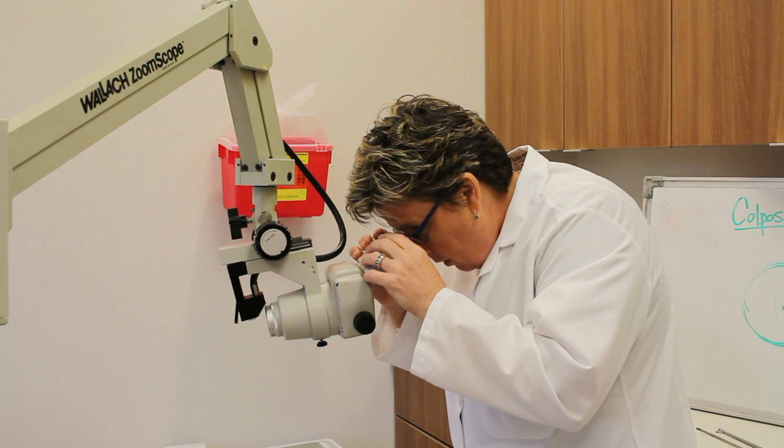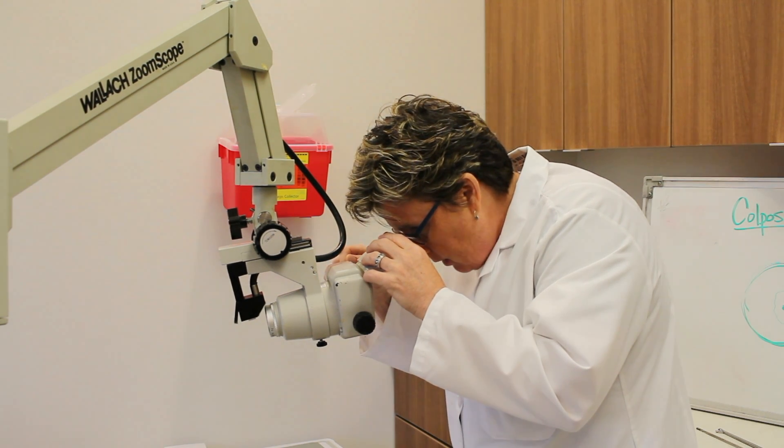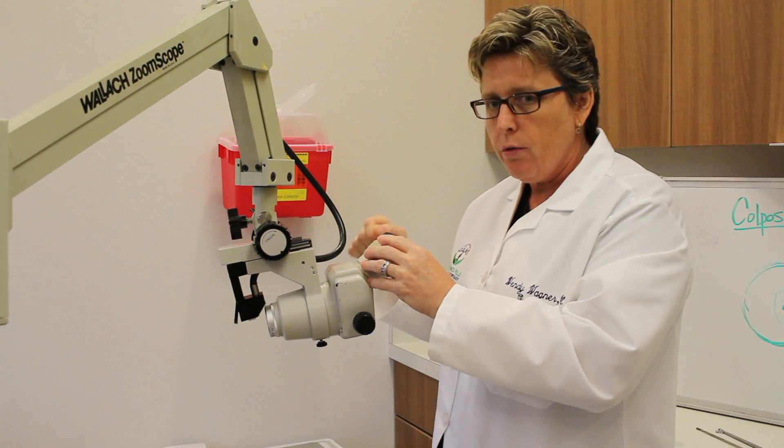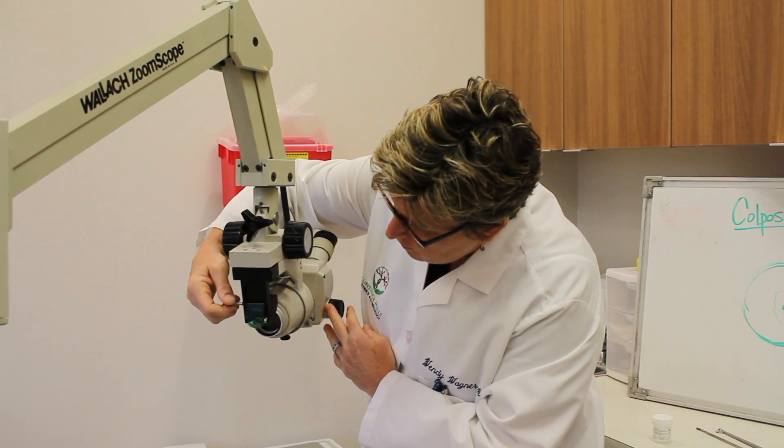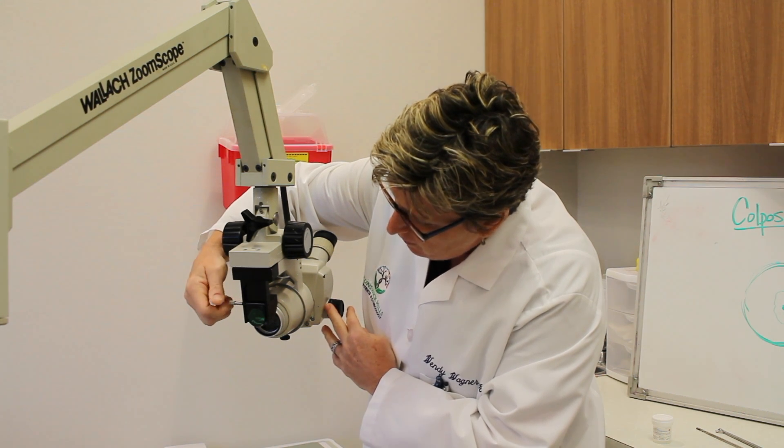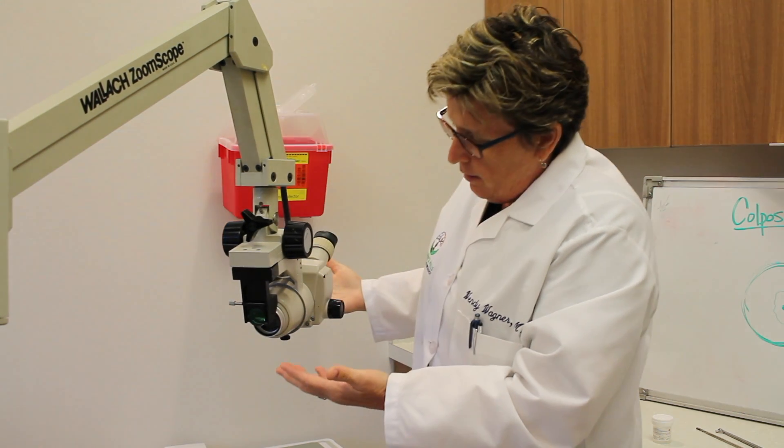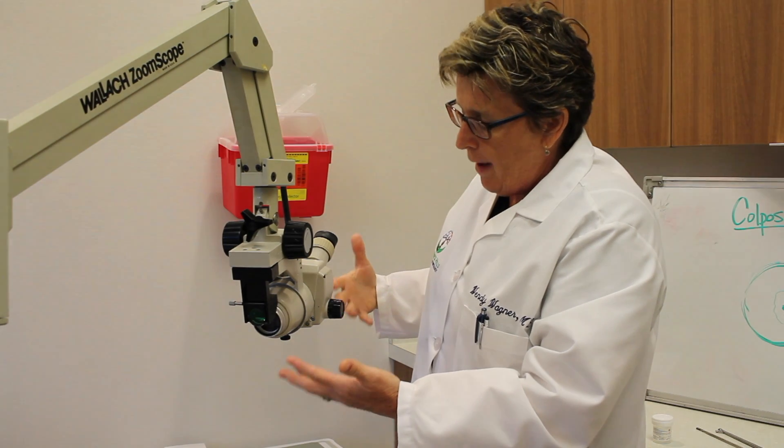The doctor will look through here, put the acetic acid on, and just take a look at the entire surface of the cervix. Sometimes we use what we call the green filter to look for abnormal vessels, but basically nothing scary. It's just a magnification scope.